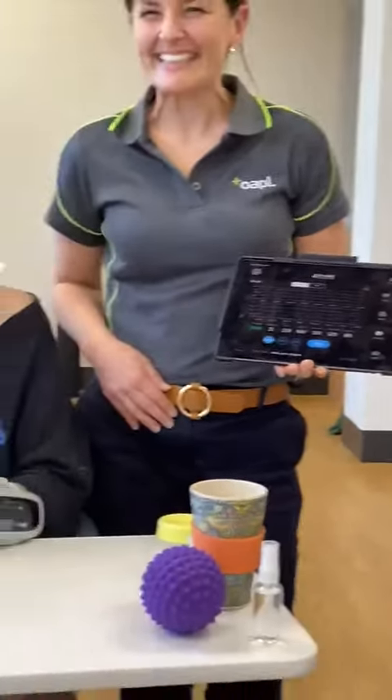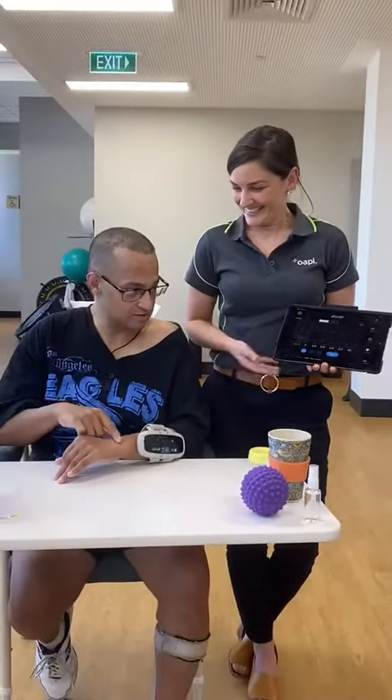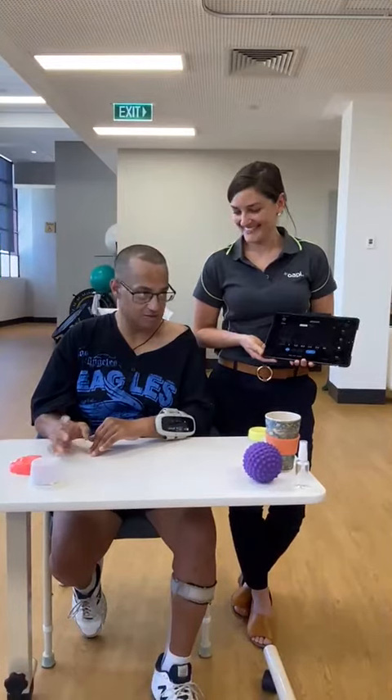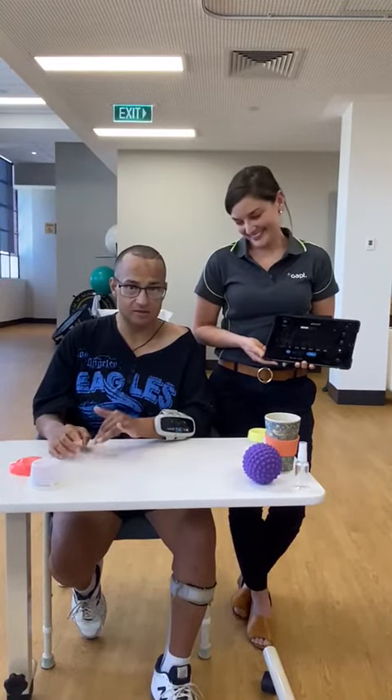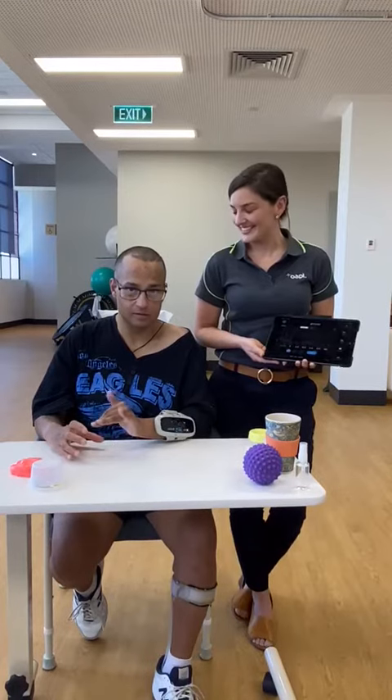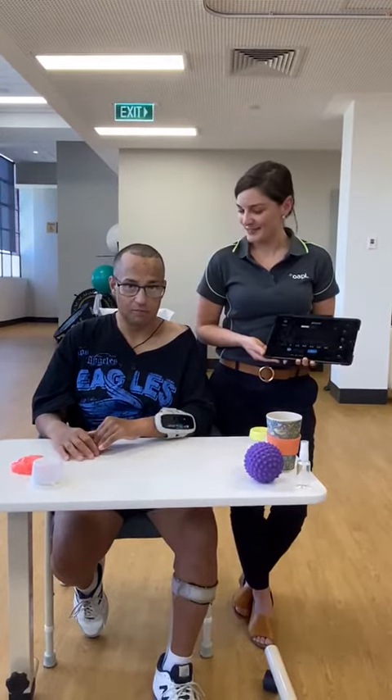Omni High 5. My brain is actually doing this. I'm working for this, right? The machine's not doing it — I'm actually doing this. The machine is assisting you, but you're doing most of the work. I'm doing the work.